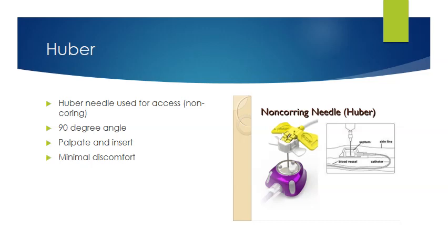You can see how this needle goes straight in there. And if you look at that little picture over to the right, you see the septum where the needle has gone straight in, and the skin line where it's underneath the skin. Okay, and then how the catheter feeds into your blood vessel. So look at that little picture there, and it kind of shows you how this port would work. You palpate it to insert it.